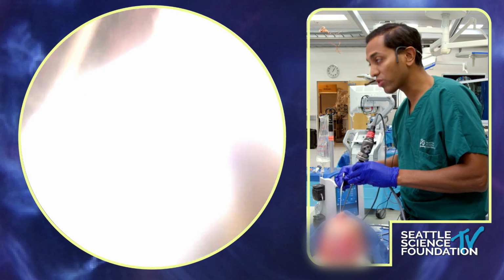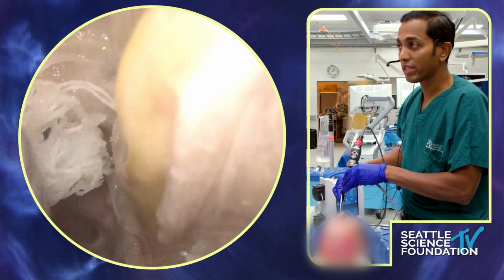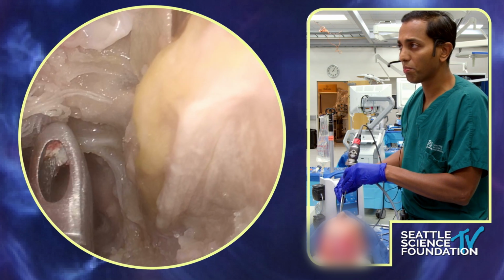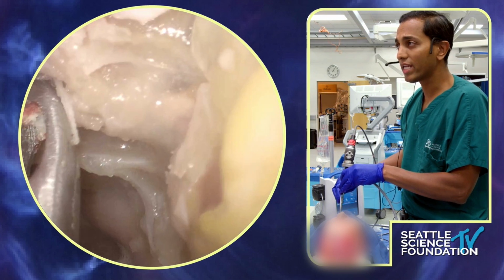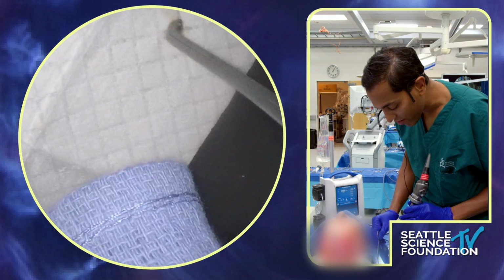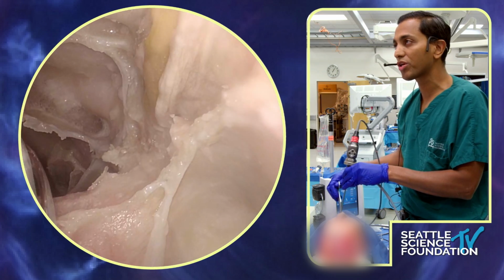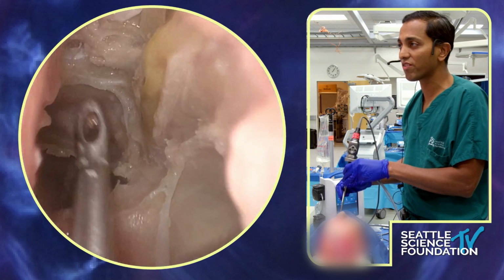So then, essentially what you're going to do is you're going to find that hole right there, and you're just going to gently tuck this dural matrix in there. You can use, often, a little ball probe looks really nice, and you tuck it there, and it is going to stop leaking at that point. And then you're going to place a little bit of glue over that. I think my grafts are not going to be good enough, team. But otherwise, that's where you then would go in and lay that graft right over that area, and then place a little glue, and that's your CSF leak closure.